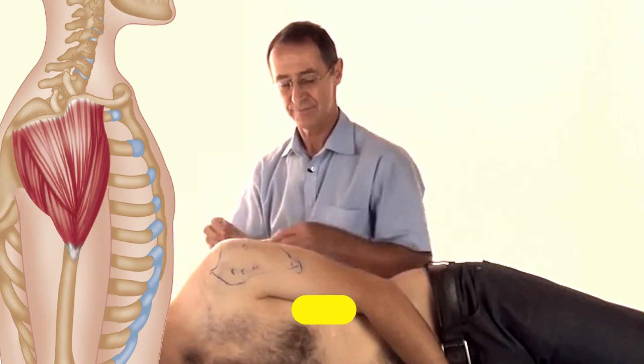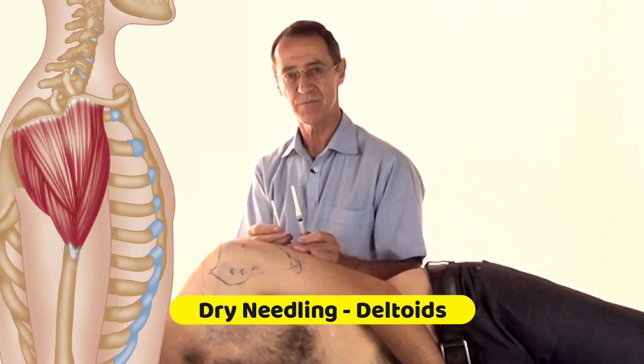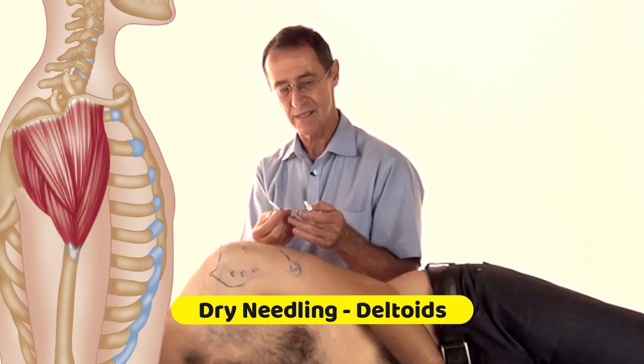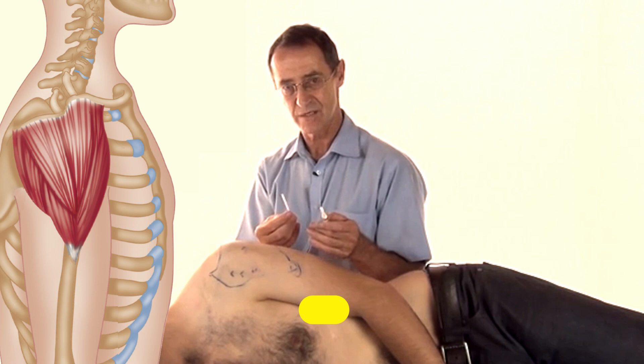We're now going to do wet and dry needling. Please do not proceed with either of these techniques if you are not certified to use needles and injections in your state or in your country.